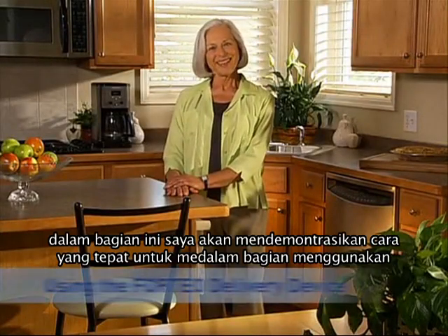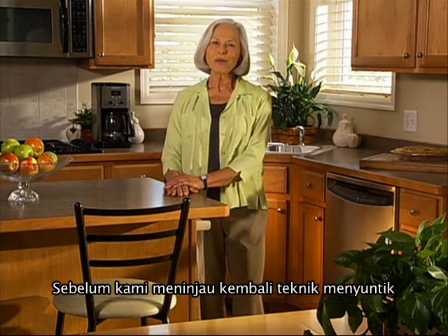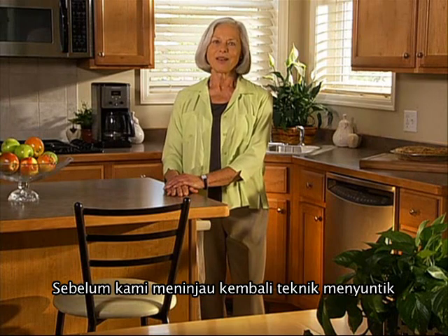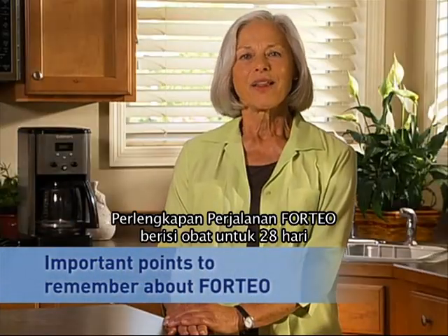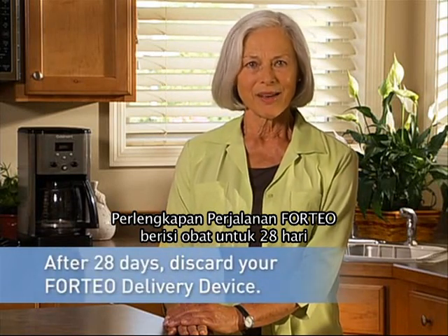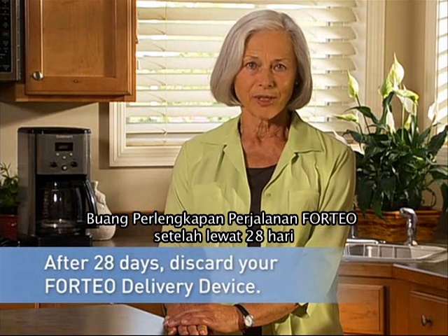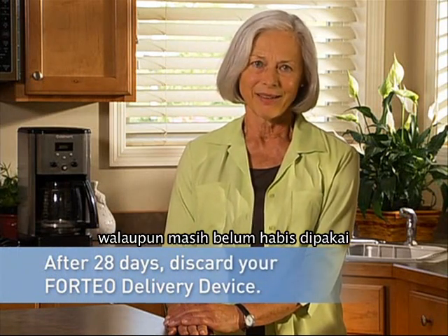Hello. In this section, I'll be demonstrating the correct way to use your Forteo delivery device. Before we go over injection technique, here are some important points to remember about your Forteo medicine. The Forteo delivery device contains 28 days of medicine. Throw away the Forteo delivery device after 28 days, even if it is not completely empty.